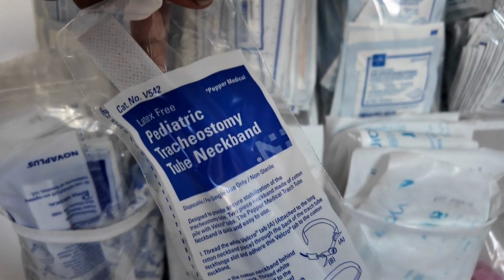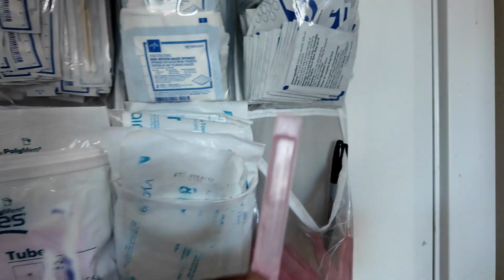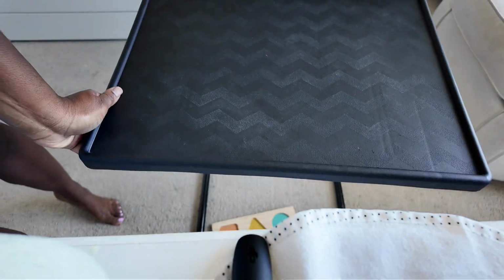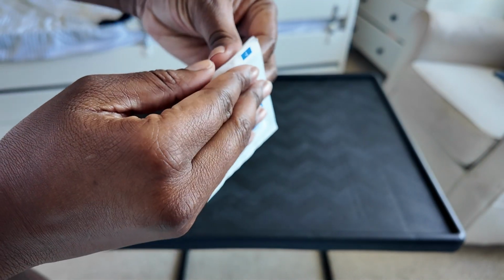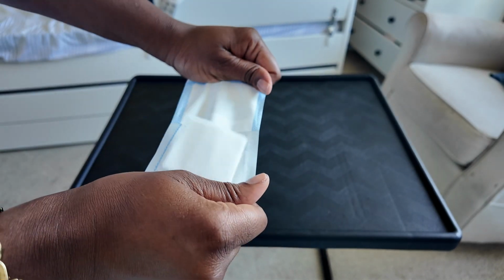And we did trach care every other day. Some others do it differently. When we got home from the hospital, we did it every single day, but these were always our essentials for trach care. So we use this TV dinner tray. Sometimes we do it on the floor and we have a different setup. But what you didn't see is I washed my hands, I sanitized them, and then I also wiped down the tray with an alcohol pad. And now I'm going to open up this gauze.